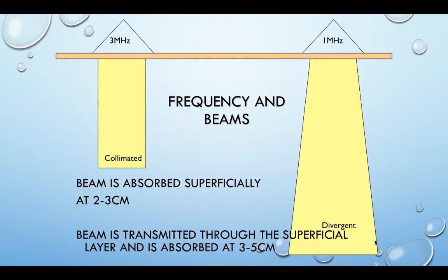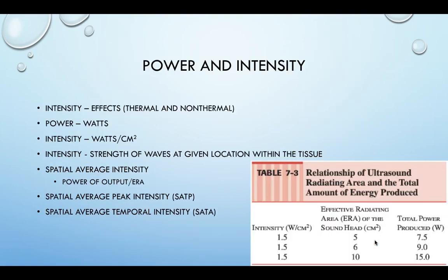So the superficial on this is about a third as long to absorb to the proper heating temperature than the 1 megahertz. So it's going to take about 3 times faster at heating than the 1 megahertz.